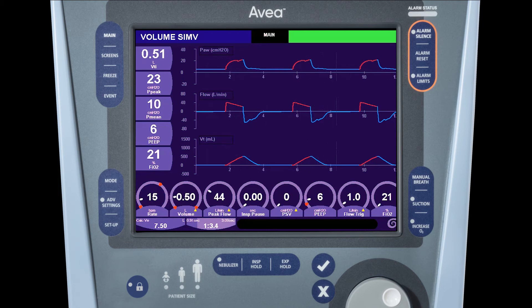You'll also notice that if you make a control change and do not accept it within 15 seconds, the ventilator will restore the control change to its previous value. All control changes must be accepted.